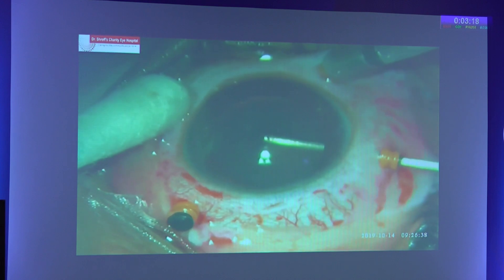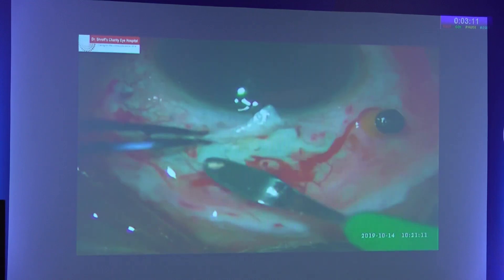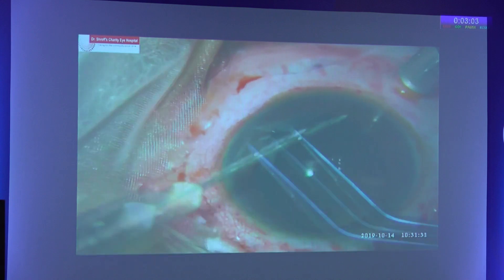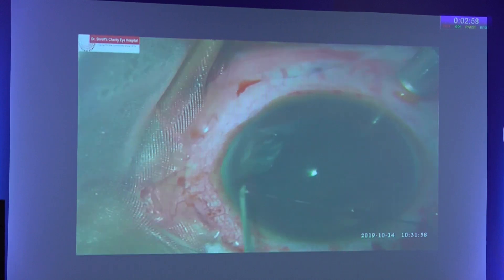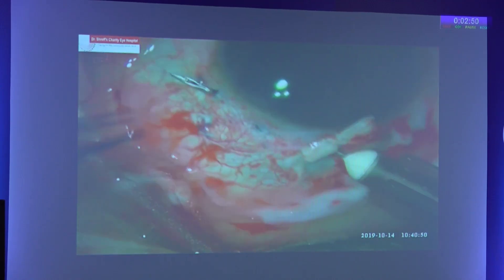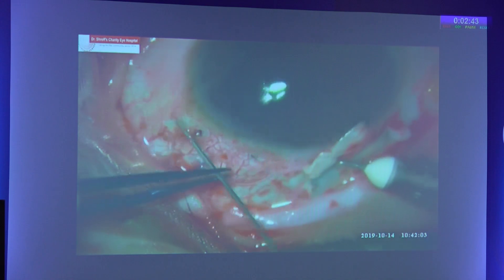Lensectomy and vitrectomy were done, followed by intraoperative gonioscopy to confirm the extent of the cleft. A scleral flap was made and a 10-0 prolene suture was threaded into a 26-gauge needle. The needle was then cut off. The needle with the prolene suture was passed through the cleft, and a loop was taken out, which was kept in place with the help of a 30-gauge needle.